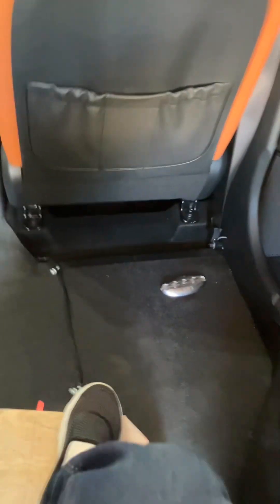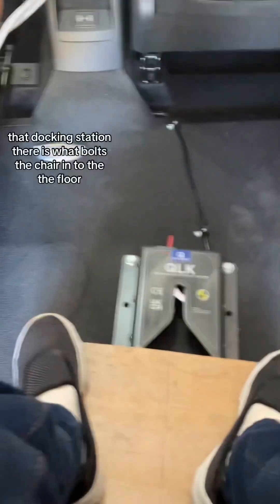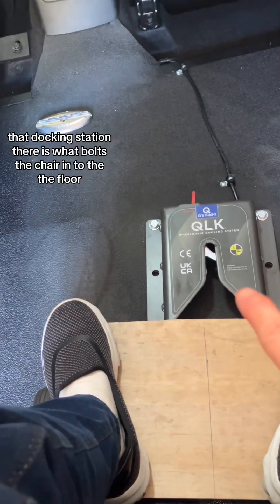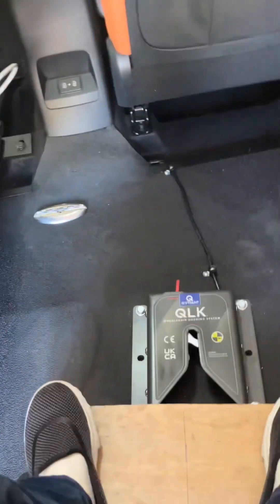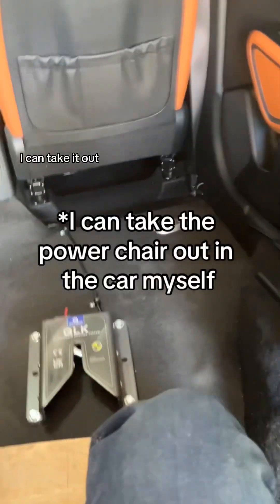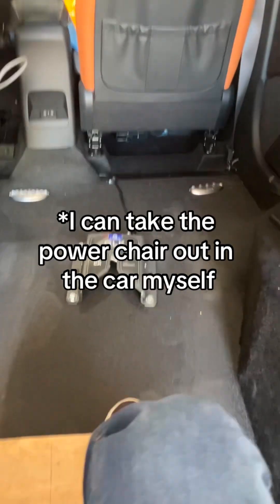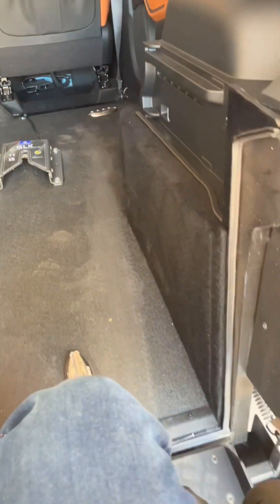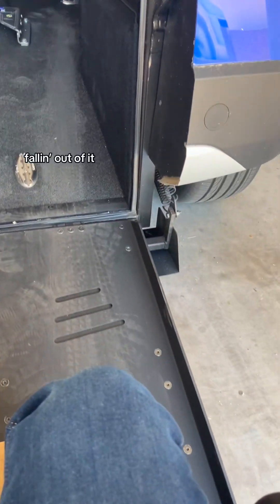So I don't fall out of the chair — backing out of the Q-lock. That docking station is what bolts the chair to the floor so it won't move around while I'm driving. I can take it out. Now it's backing out of the ramp without falling out of it.